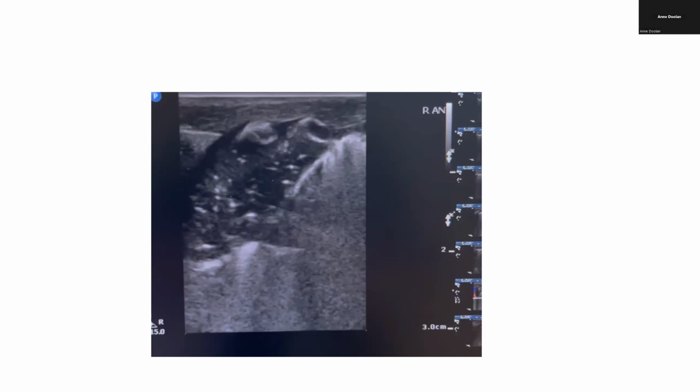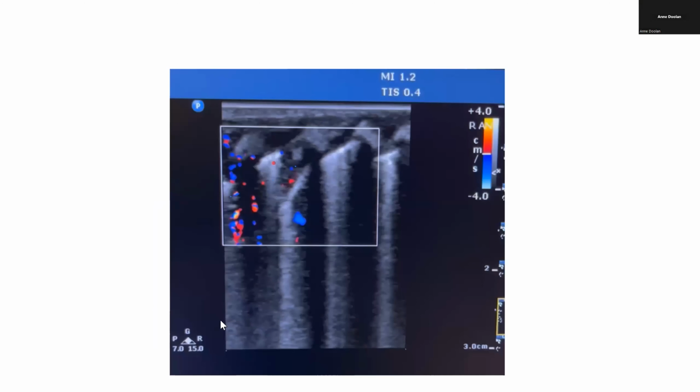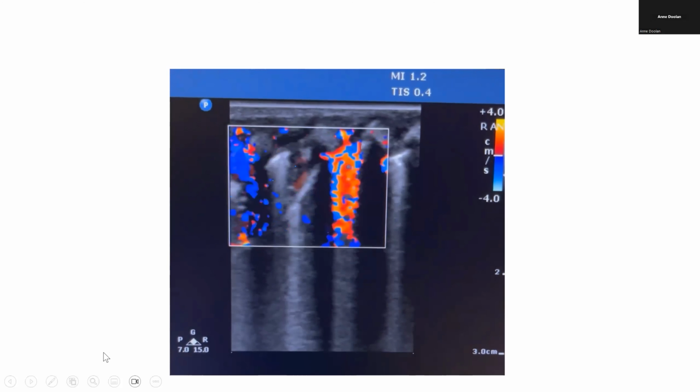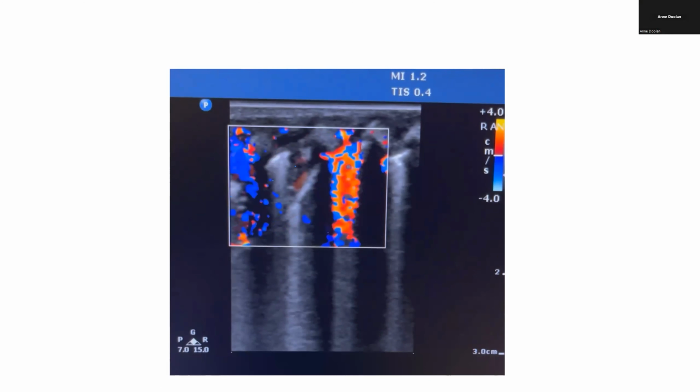Now, I took a Doppler, but I'm not sure. I was looking for blood flow, but I'm really not certain what I'm seeing. A very good example of blood vessels is seeing them in a focal area. This kind of lights up everywhere, and for that reason I'd be a little nervous about saying there's increased blood flow in that region. Your scale at the moment is 4, is it? You probably want to get it to about 8 or 9.